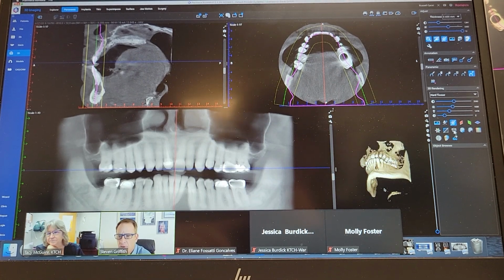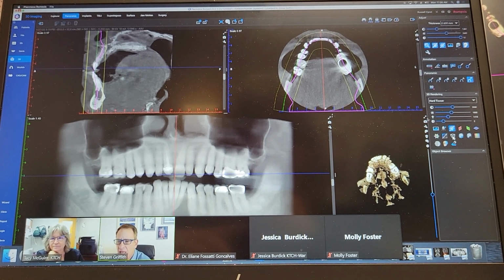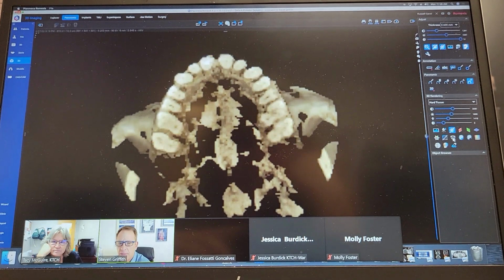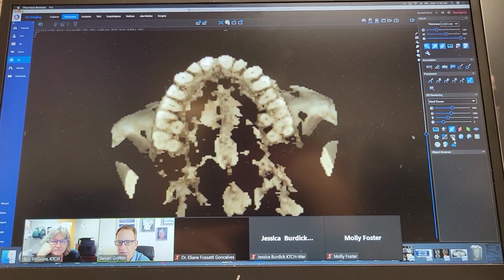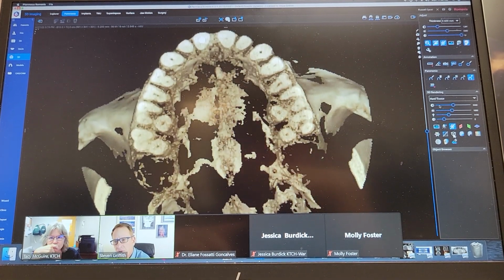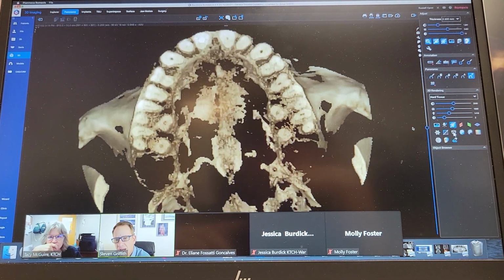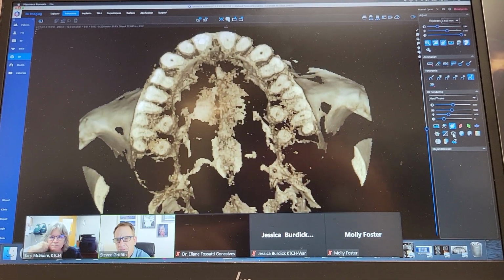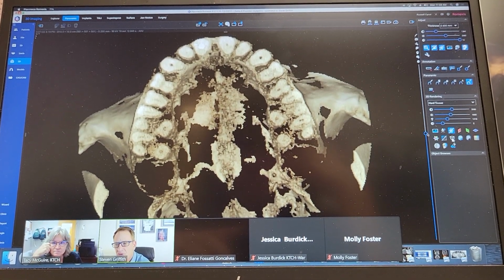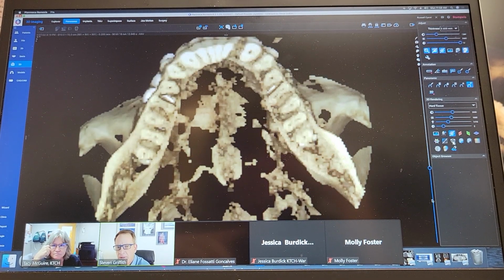Wow. But yet you've got all of this information. And believe me, this guy's got a lot more stuff going on than what you're even seeing here. He's got all kinds of stuff. But even in this ultra low dose, I want to show you. Let's blow this up. I noticed this. In this very low dose, I can hone in and I can see those canals. I can see the smallest canals. Right? Any other questions at all? Anybody think of anything?